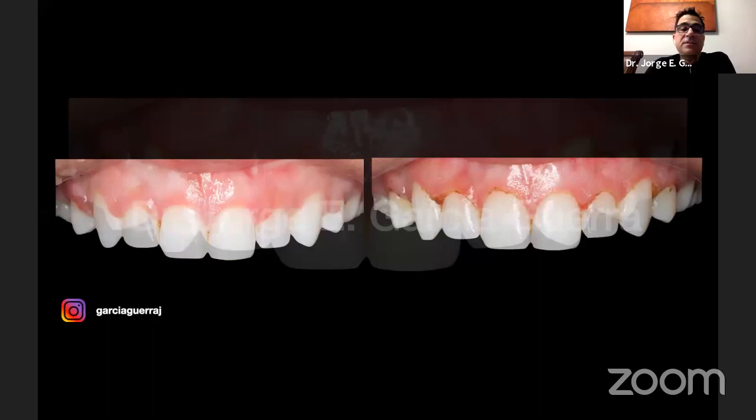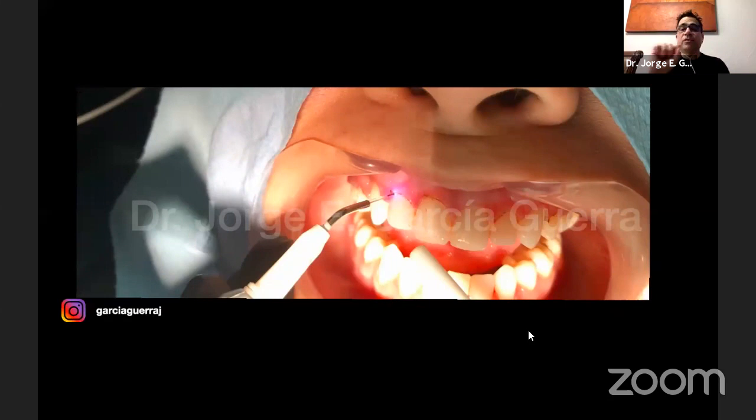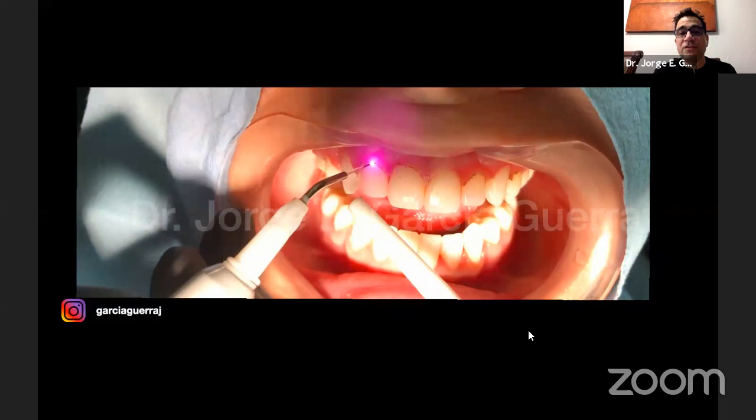This is the same day. It's very easy. You need to put some anesthesia, and you can see here this little video. This is with a laser, so you're like erasing the gingival tissue. And it's very easy.